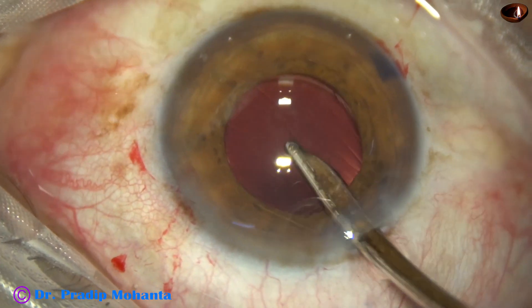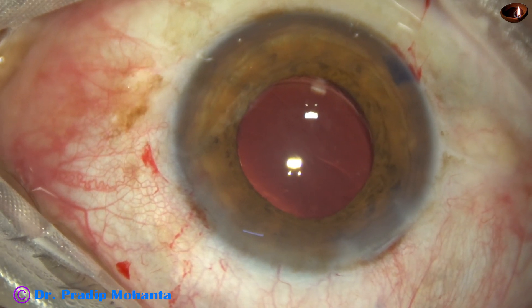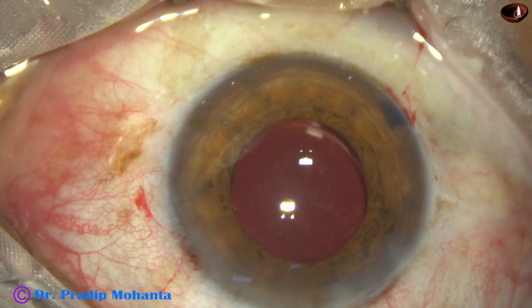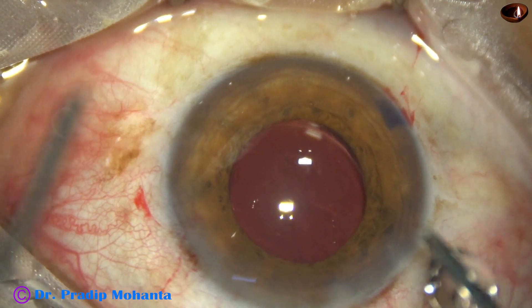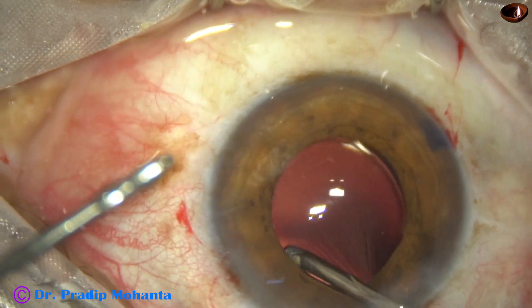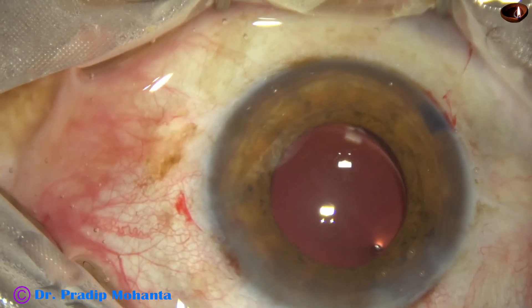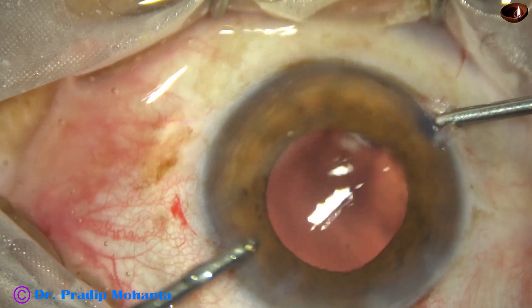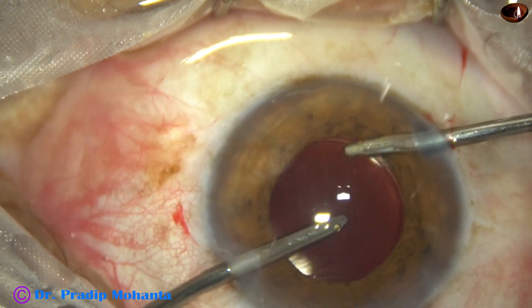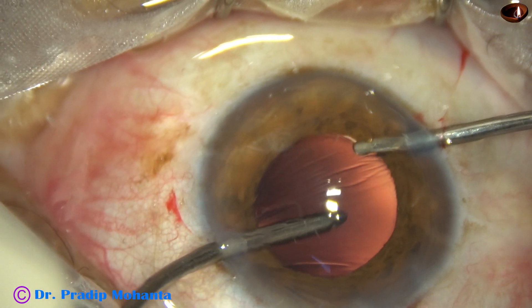Removing the visco from the anterior chamber. And now I go behind the intraocular lens and remove the visco that was there between the posterior capsule and the intraocular lens. Nice cleaning of the visco is important because if we do not do this, there will be raised intraocular pressure and steamy corneal edema — the patient will be very uncomfortable. Using the bimanual irrigation-aspiration device; irrigation and aspiration being used together through two side ports.